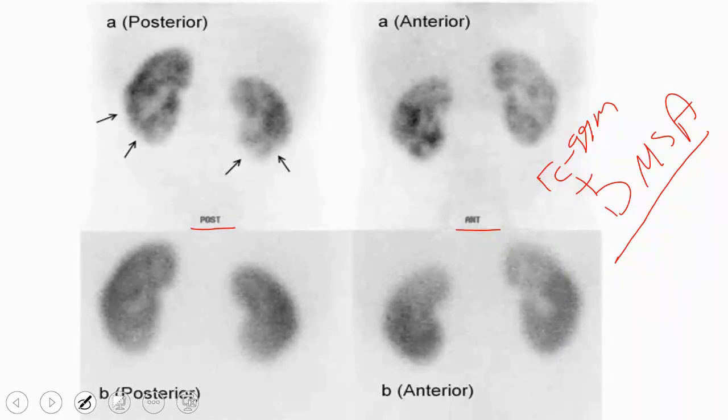I want to take images, for example, by injecting the patients and then imaging after a few hours to prevent leakage of the substance, capturing a static image in front of me. I start by identifying areas with scars and those that are not absorbing the radioactive material. How does this work? Simply put, the patient is positioned and a static image is taken. It is called a static image because the patient is still and the head is fixed.